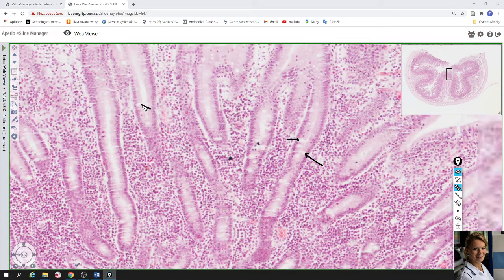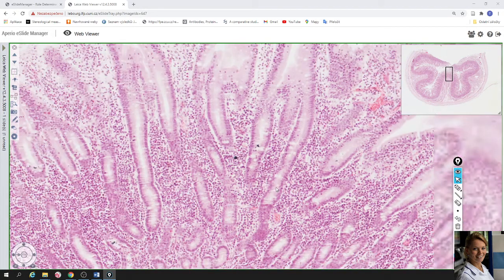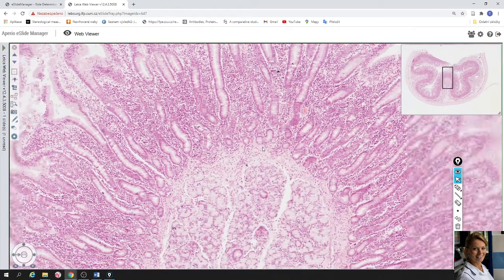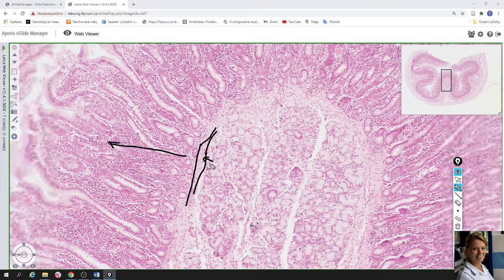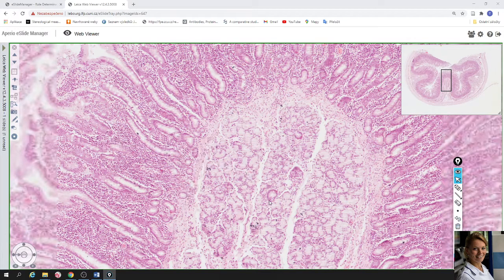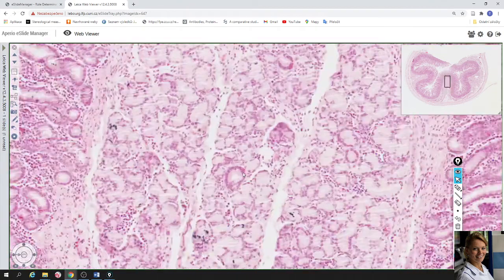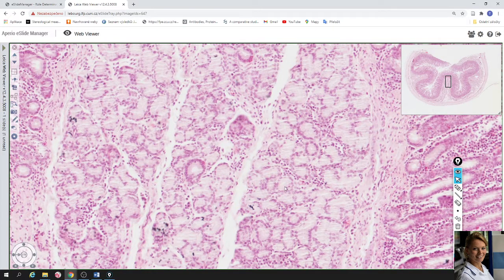Here again are goblet cells. The nucleus is in the basal compartment of these cells and the apical part is filled by mucus. Here you can see the last layer of mucosa called lamina muscularis mucosae — this is the thin layer of smooth muscle cells. Here is the mucosa and underlying is the submucosa.